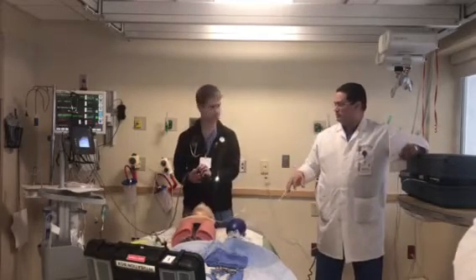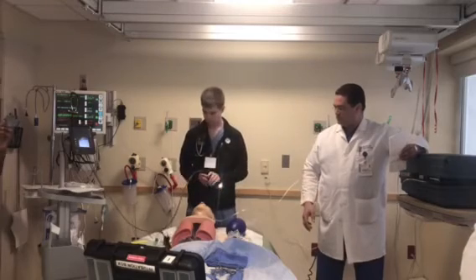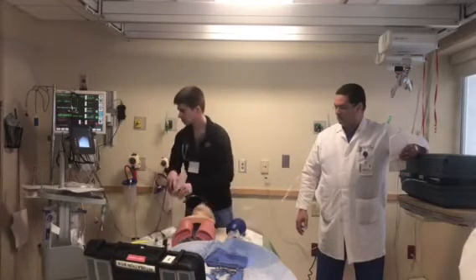Now, let's say it's not better. Or you want to just do it quickly, just to get the view, that's fine. But quickly.